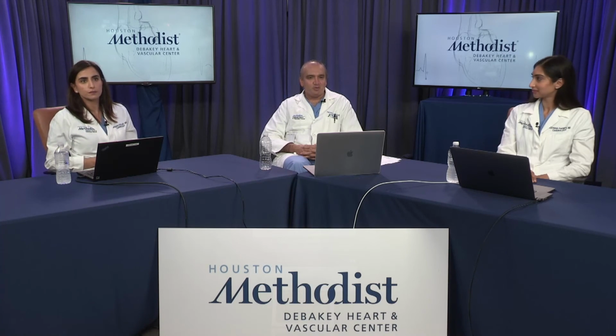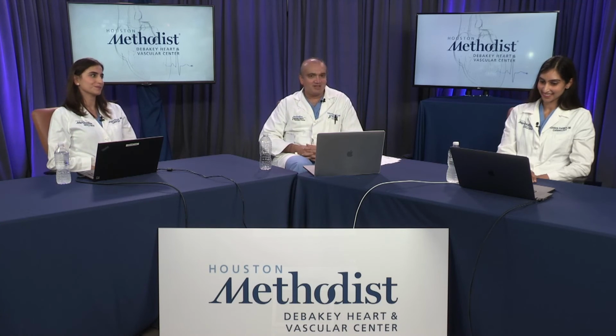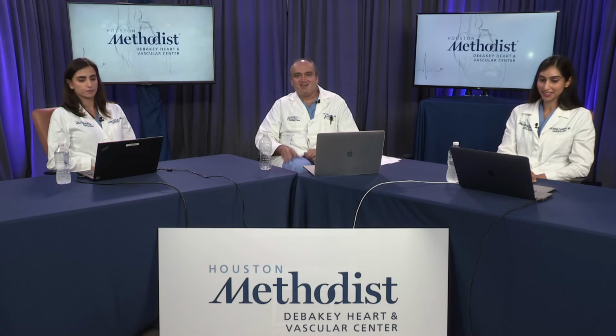So this will be interesting for me as well, since I've never seen this. I'm looking forward to it. Roosha? Thank you, Dr. Shah, for the introduction. So I'll go over my case of the reverse Lampoon. Lampoon stands for intentional laceration of the anterior mitral valve leaflet to prevent left ventricular outflow obstruction, assisted TMVR.